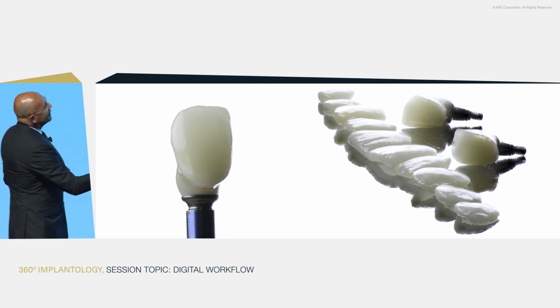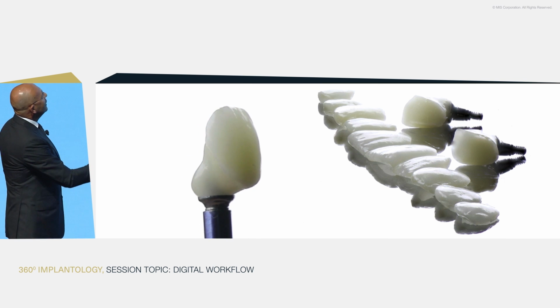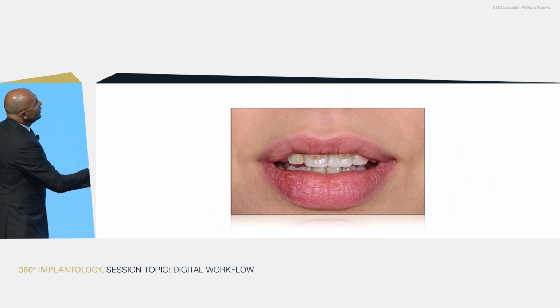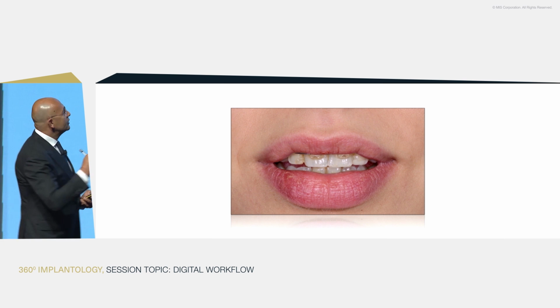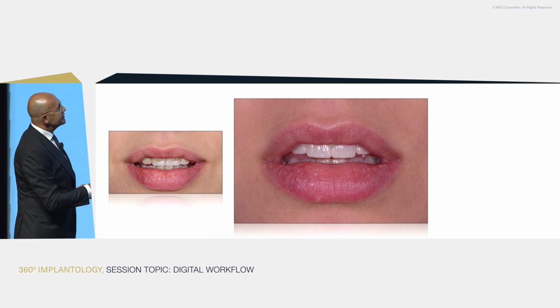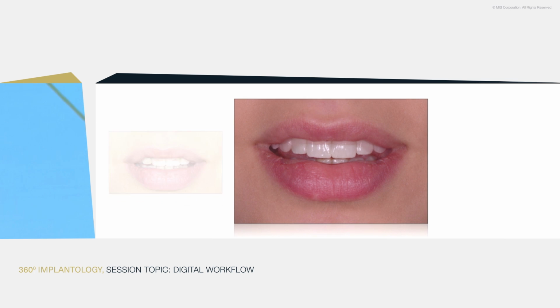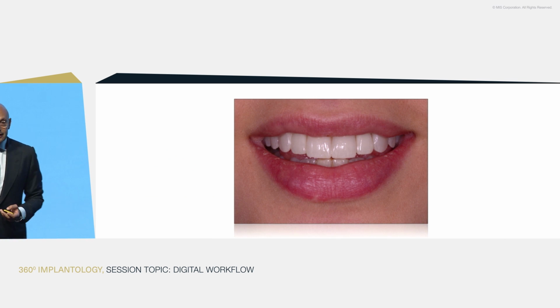And then these are the veneers done over the abutments, and now we can see the abutment and the veneer outside with the beautiful surface texture. This was how I started. That was our base point to start our mock-up, and this is what Gurel finishes with the porcelain. So this is the look from the lips, half smile, full smile, and bigger smile.